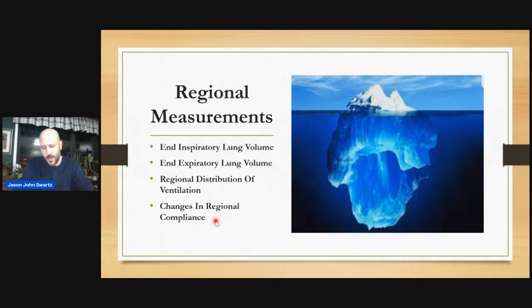I use APRV, like I said, in select patients in our ICU with very, very good results. So we also can use the customized analysis on the PulmoVista 500. What we'll do is set our P high at different levels. Often, if we're in a conventional mode, we'll transition with whatever the plateau was in conventional mode as a starting point for P high.